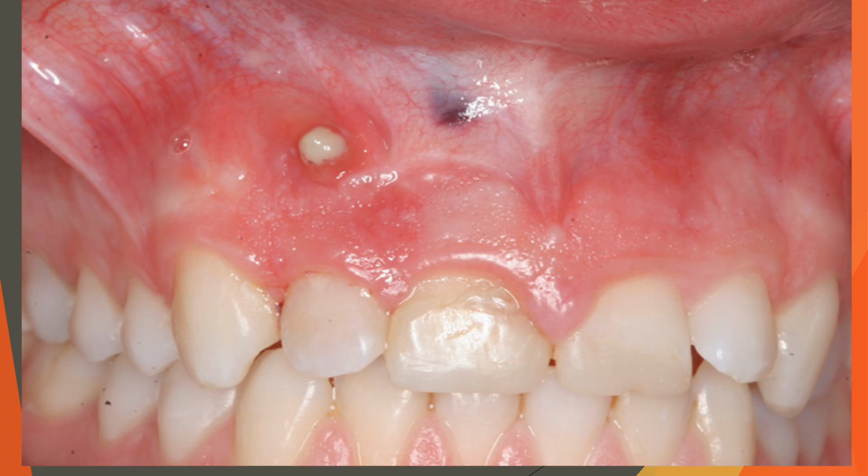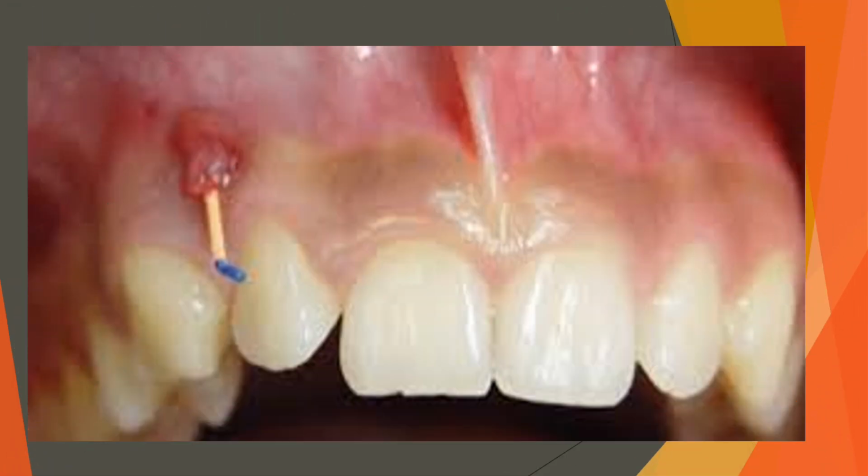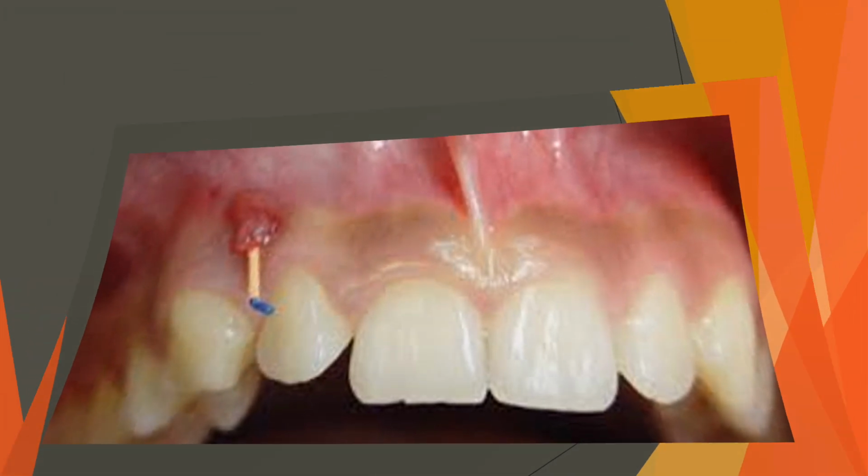Like this, we have to be sure that there is no lesion. If there is a fistula like this, and we don't know if it's related to any tooth, we do gutta-percha tracing. We put the gutta-percha in the fistula to point to the area or the related tooth we need to treat. Let's see the definition.